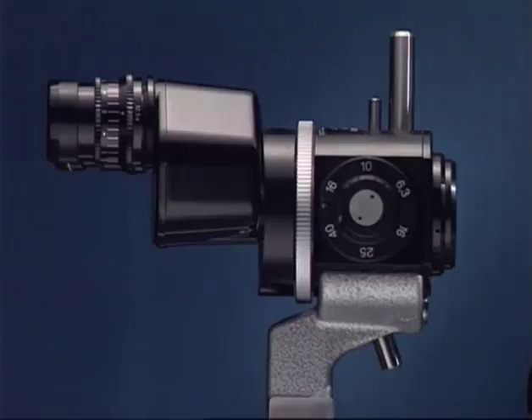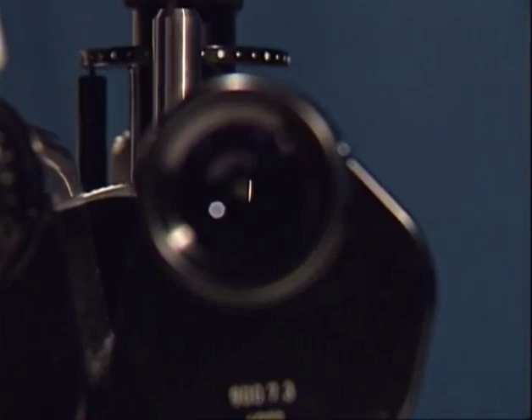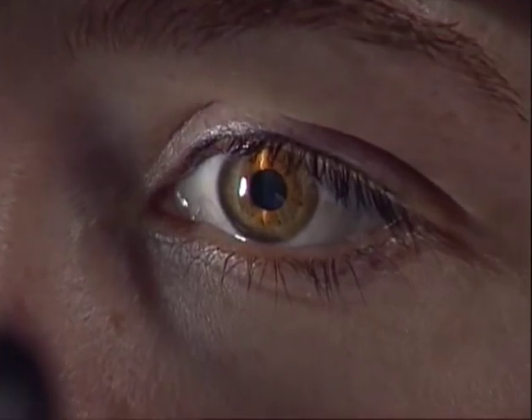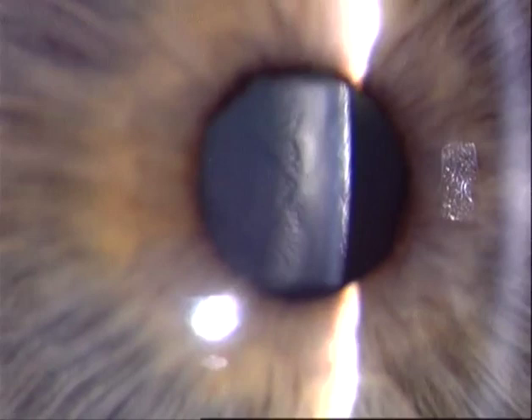The slit lamp is a combination of an observation system and an illumination system. The illumination system provides more than just general illumination of the eye. The illumination beam can be shaped to an optical instrument which can render invisible tissue visible. The illumination beam can even provide an optical dissection of the eye, as illustrated in Part 1.